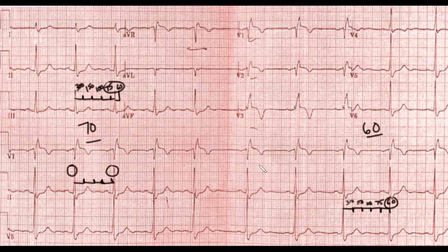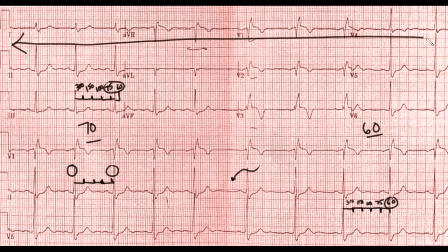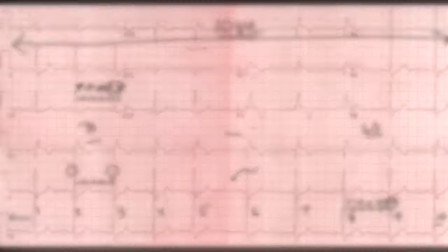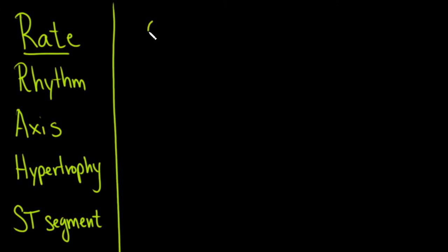It looks as though something happened right about here, where there was a change. Remember the entire strip is about 10 seconds. If we count the QRS complexes — one through ten — and multiply by six, we get just over 60. So the rate is somewhere between 60 and 70 beats per minute.